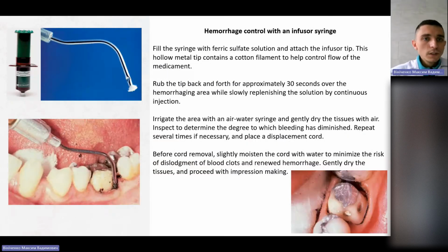What about the retraction? Hemorrhage control with an infuser syringe. So here is a special syringe. You could use this.